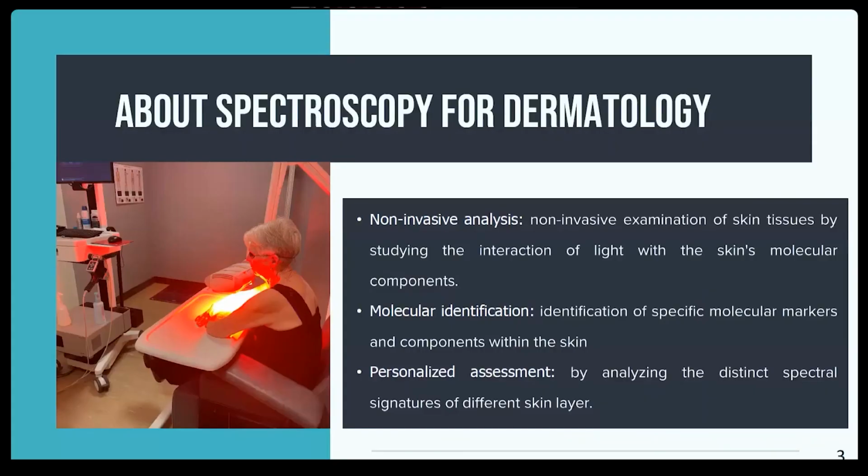But fortunately, today more and more technologies are being used to help cure this skin disease, and one of them is spectroscopy. It's a non-invasive way to study how light interacts with the skin's molecular components. So we have access to these molecular identifications, and then we can assess a very personalized treatment for the patient.